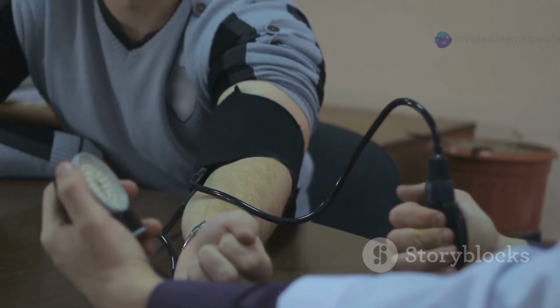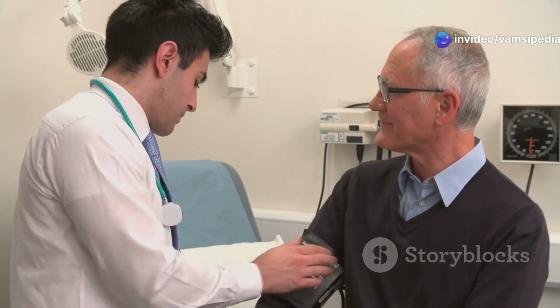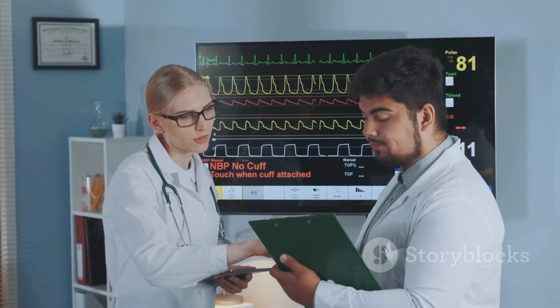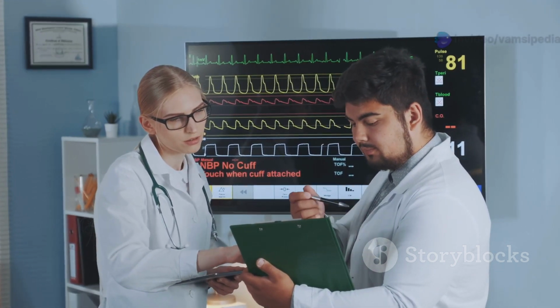Blood pressure response during exercise should be monitored closely. Normally, systolic BP rises while diastolic BP remains stable or decreases slightly. Abnormal responses can be signs of cardiovascular problems like ischemia or even autonomic dysfunction.